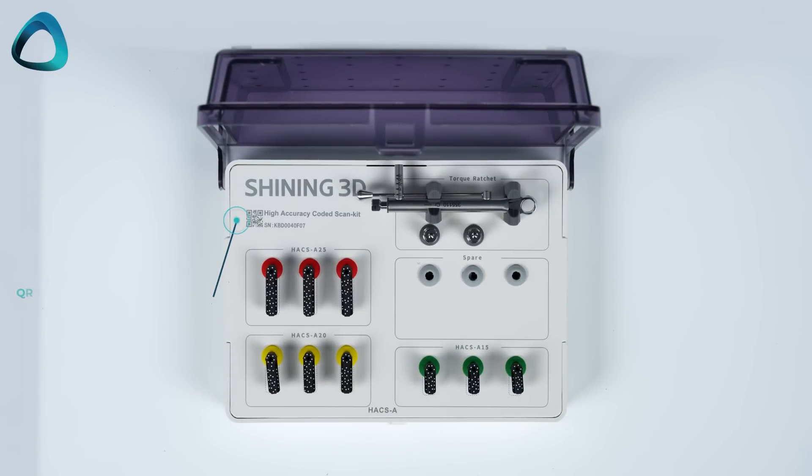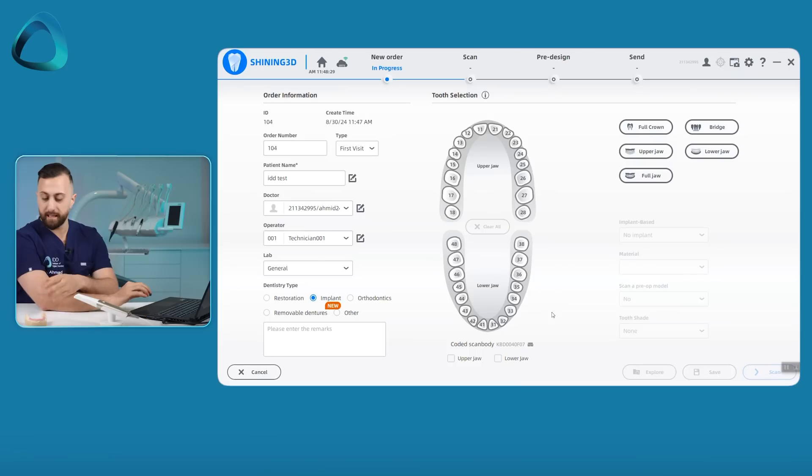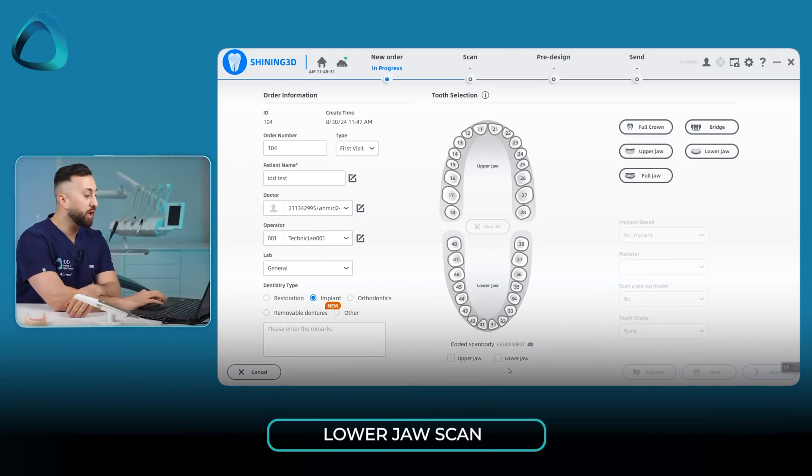Each one of these high-accuracy coded scan body kits that the company sends with the scanner has a QR code and a barcode or serial number. You put this into the software and now it's all connected — the software knows which specific kit you are using. You just have to inform it which jaw you are going to scan, and in this case we are going to do the lower jaw scan.